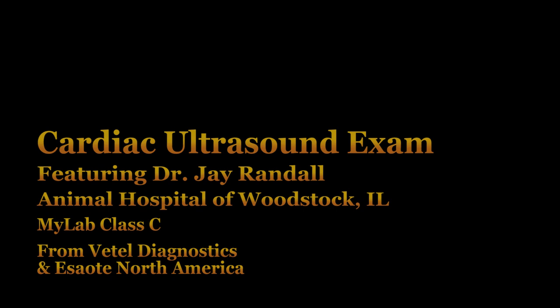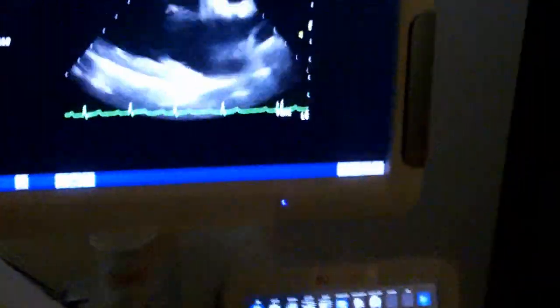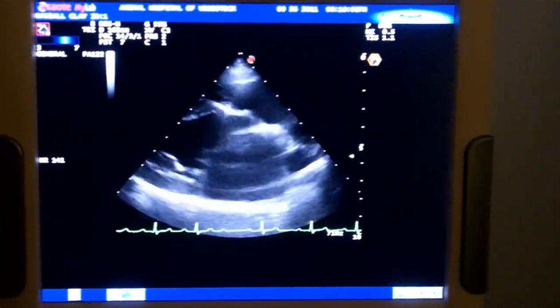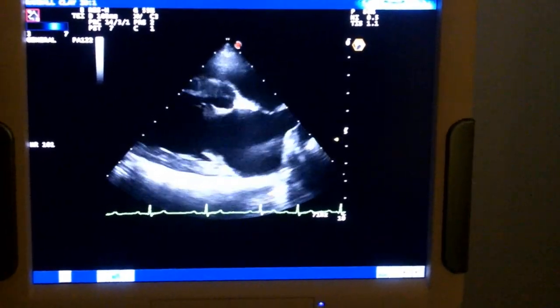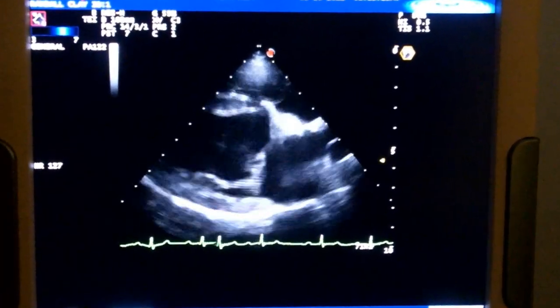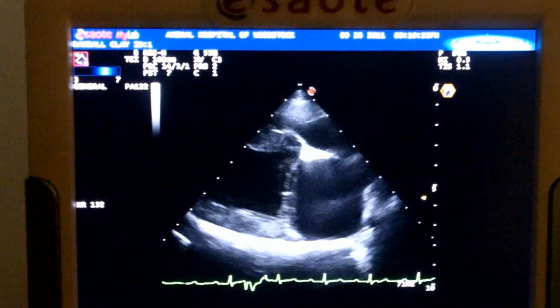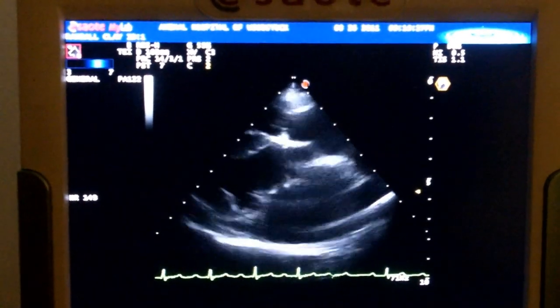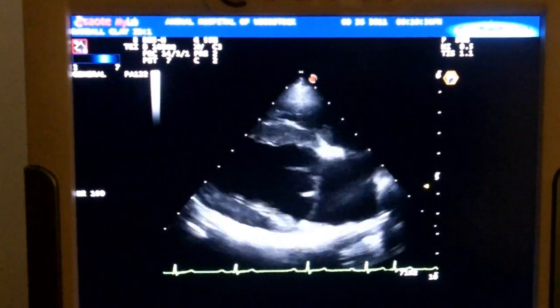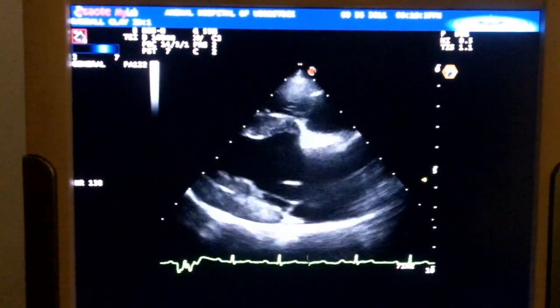This is a 13-year-old dog that has a bit of a heart murmur, and we're going to take a look and see if we can find out why today. We've got a nice image of his heart right there, and we'll make just a few adjustments. The first thing I see here is he's got a slightly larger left atrium than the right atrium.